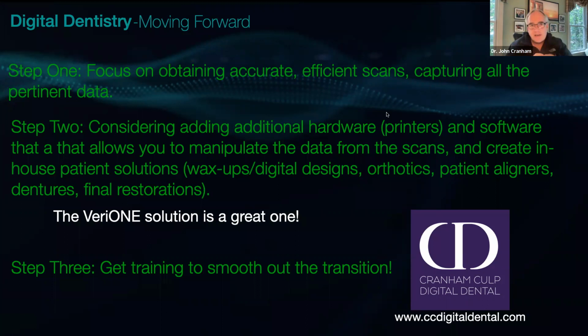And then I also have a laser. So if I feel like something's in the way, I'll just trim that little tissue where the cord is. I've tried to use the laser all by itself, but I feel like the cord does a nice job keeping the crevicular fluids dry, so you can get a really clean, dry scan of the margin, which I think is critical.